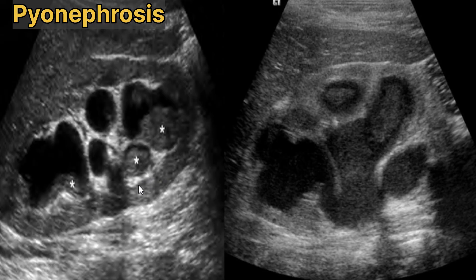Now we are going to discuss pyonephrosis. Pyonephrosis refers to an obstructed and infected collecting system. In some cases, echogenic pus can be seen filling the collecting system or layering in the dependent portion. This sonogram shows moderate hydronephrosis with echogenic material filling the collecting system, consistent with infection — that is, pyonephrosis.